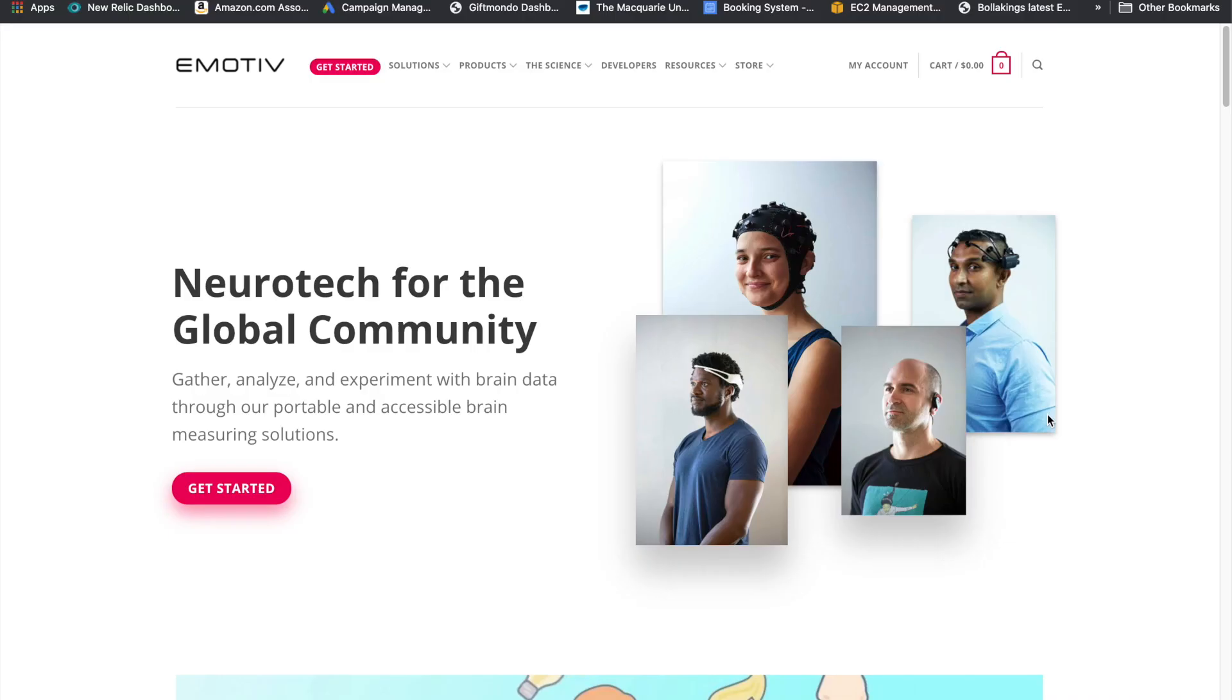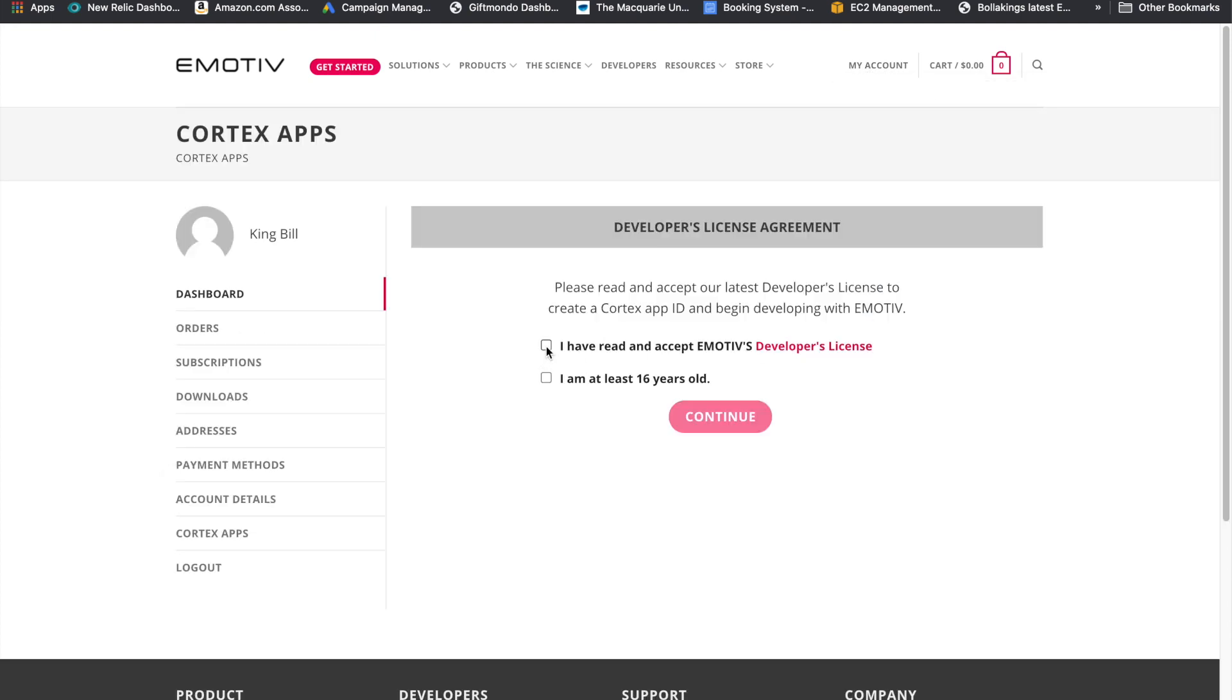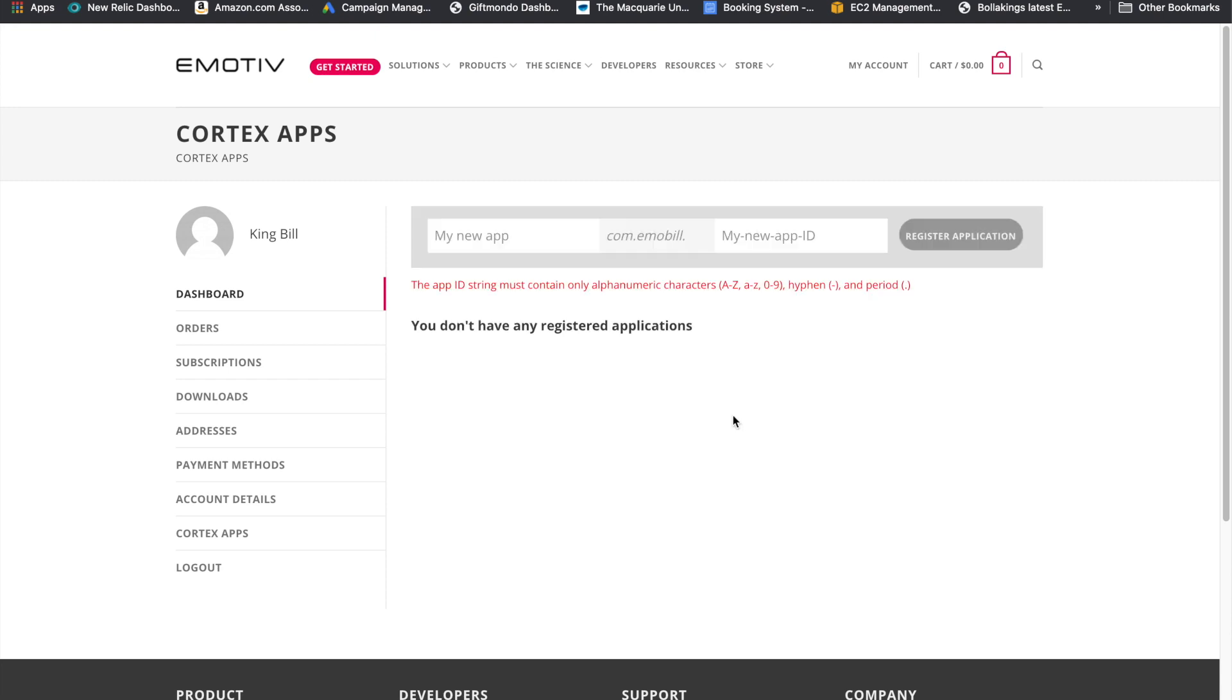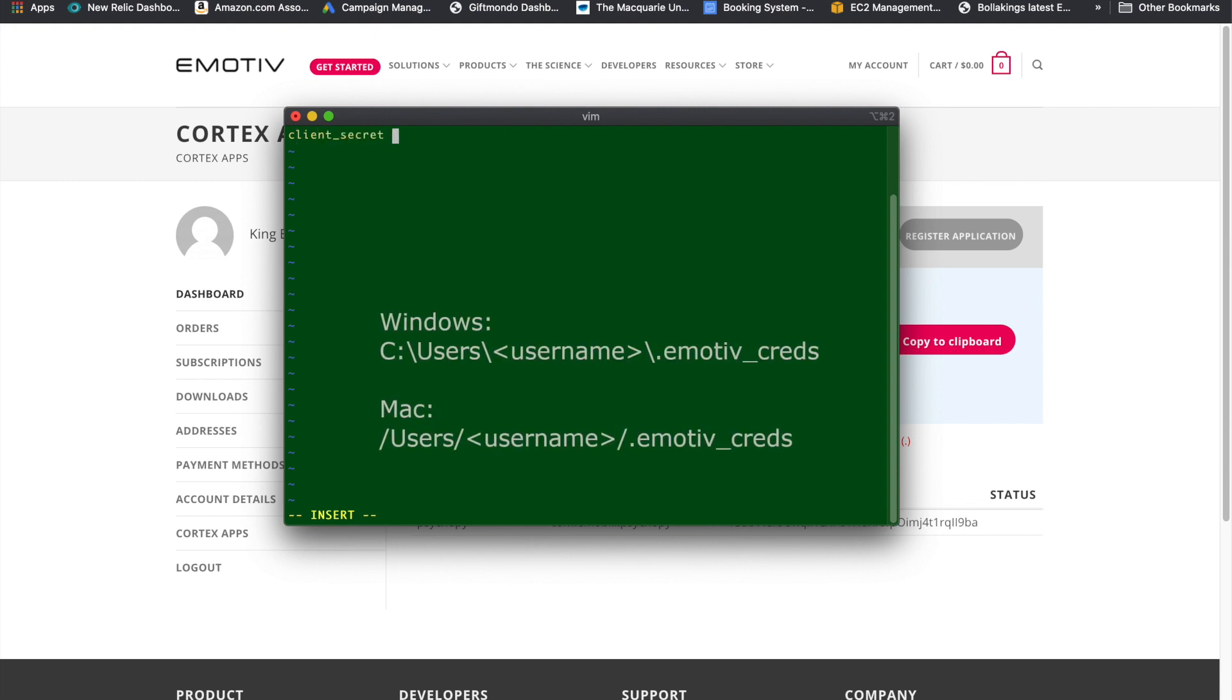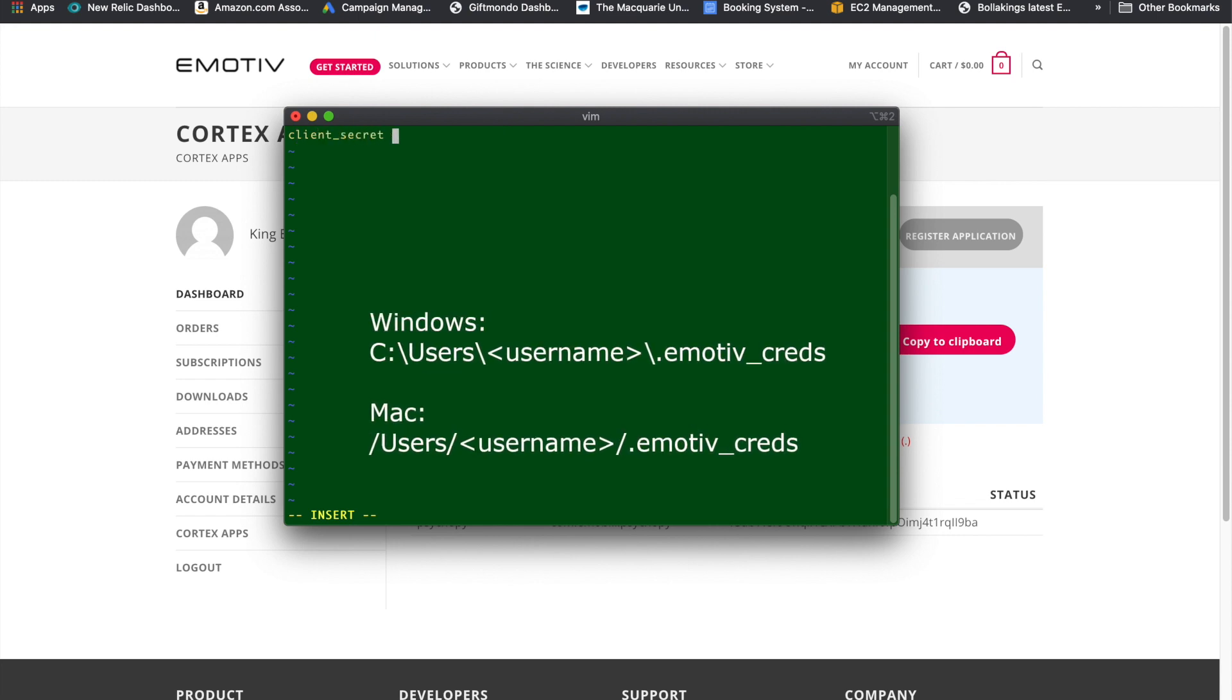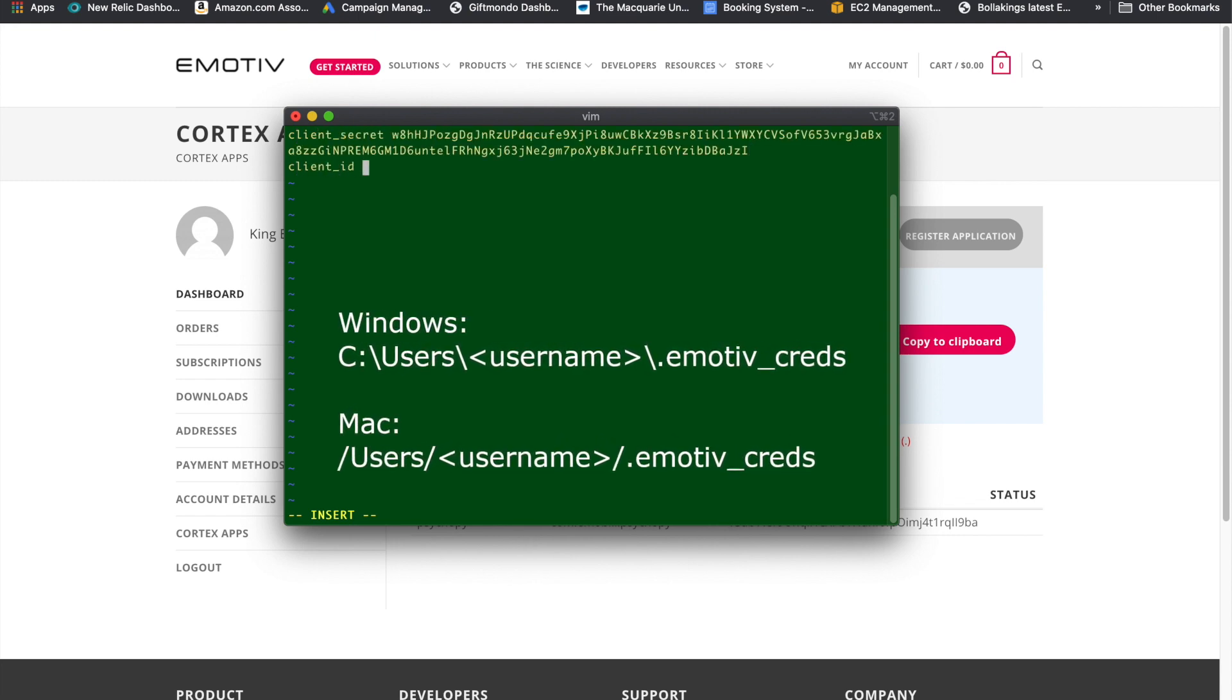Before you can connect PsychoPy to EMOTIV hardware, you need to register an app ID at emotiv.com. Log in with your EMOTIV ID, go to my account, Cortex apps, fill in the name of your app and register it. Then you will get a client ID and a client secret that you need to copy into a file called .emotiv_creds in your home directory.